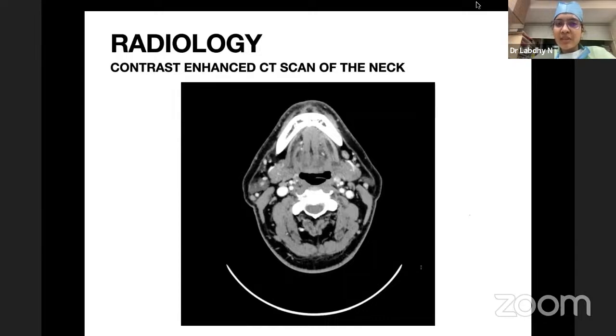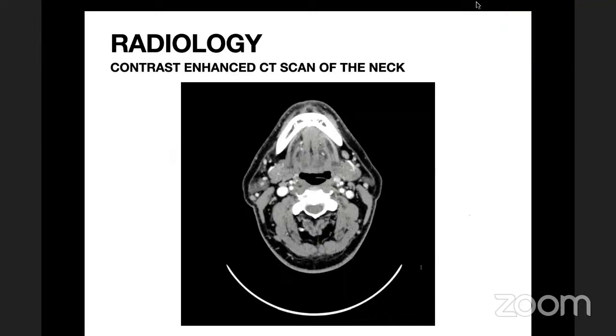Stage 2 stomal recurrence is when the superior half of the stoma is involved, with involvement of the esophagus. These two stages are salvageable, but stage 3 and 4, when there is spread into the mediastinum anteriorly, below the clavicle, may not be salvageable, sir. Okay, type, not grade. Yes, type 1, 2, 3, 4.